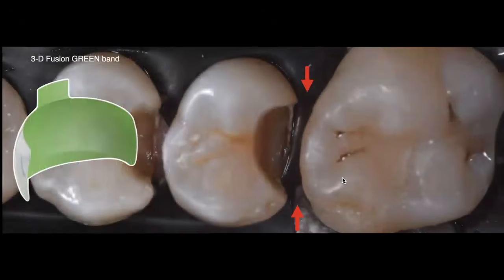So when I have cases like this, I'm still going to use my Garrison system, but I'm going to use now the 3D Fusion green band. Now, why do I select the green band even though this tooth is a premolar and the green band is better designed for molars? Well, the reason why I like this green band is because of that gingival extension. You can see it right here. This is a very tall band.